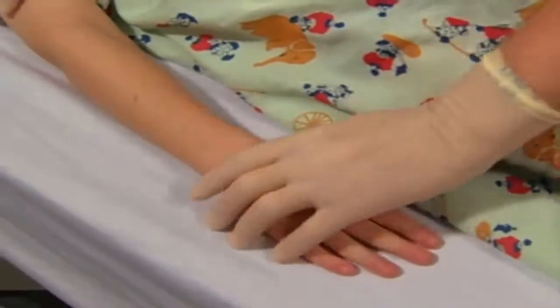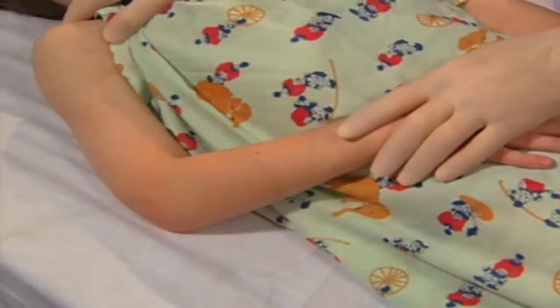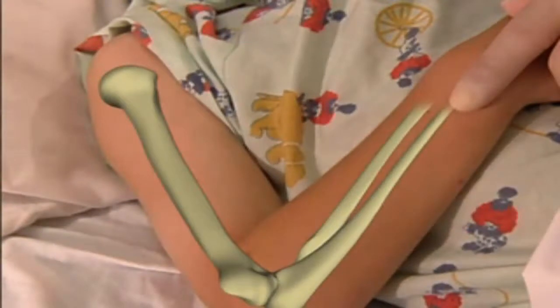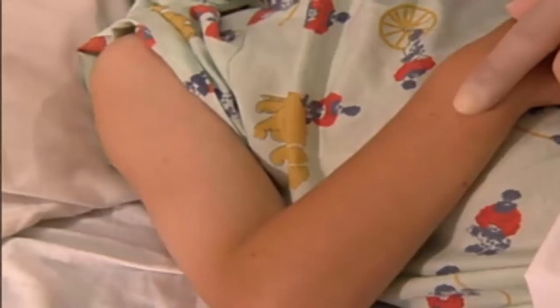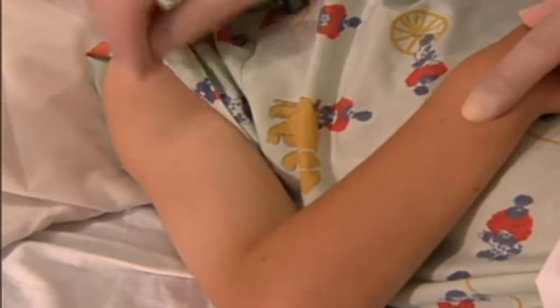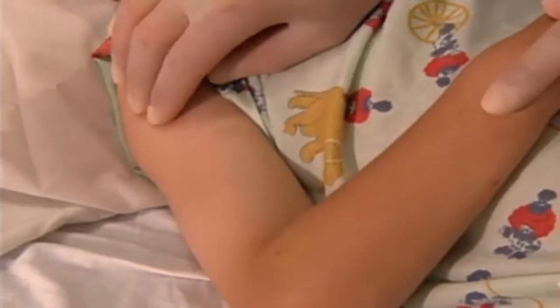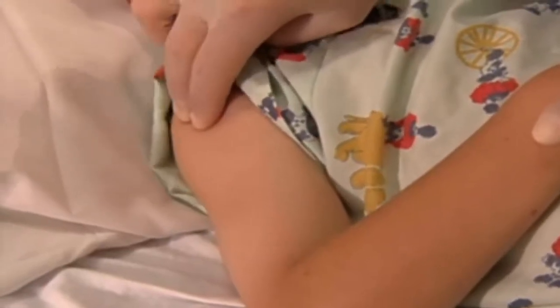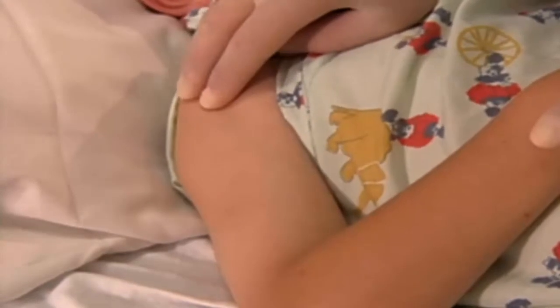When tibial sites are not available or when previous attempts have been unsuccessful, the proximal humerus can be used. With the patient in the supine position, rest the ipsilateral elbow alongside the torso. Because the overlying deltoid muscle can make identification of landmarks challenging, begin by palpating the mid-portion of the humerus in the upper arm, then follow the bone proximally until the greater tubercle is appreciated, just anterior to the midline of the lateral shoulder and distal to the shoulder joint. This bony prominence is the insertion site.